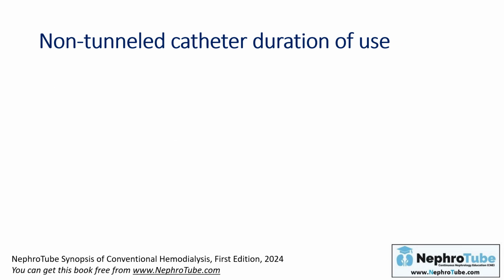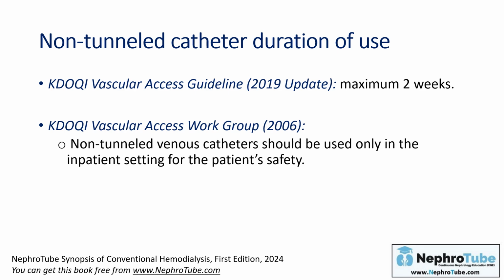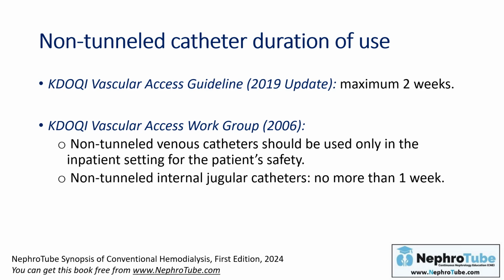Regarding non-tunneled catheters, KDOQI 2019 mentioned that they must be used for a maximum of 2 weeks due to the increased risk of infection. And I want to highlight the KDOQI Vascular Access Work Group 2006 because they mentioned good points. First, they mentioned that non-tunneled catheters should be used only in inpatient settings.